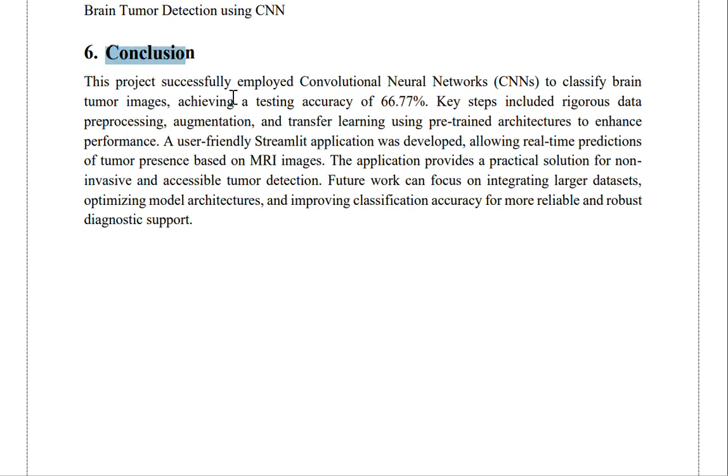On the separate testing dataset, which the model never saw during training, we recorded a testing accuracy of 66.77% and a testing loss of 0.6082. These results show that the model maintained consistent performance and could generalize reasonably well to new MRI images.